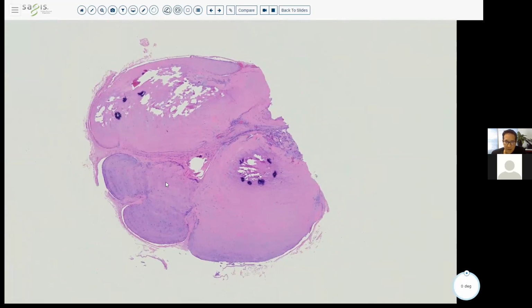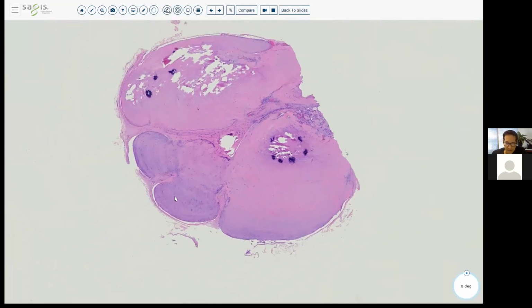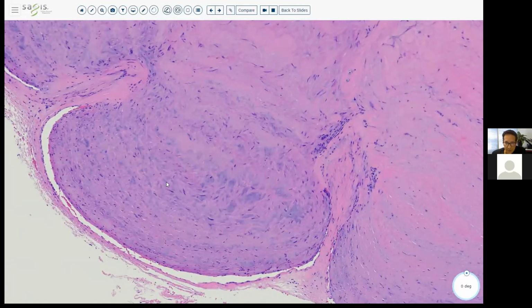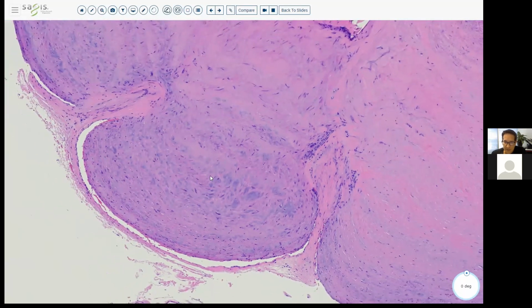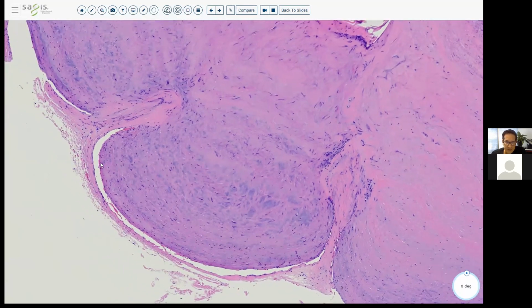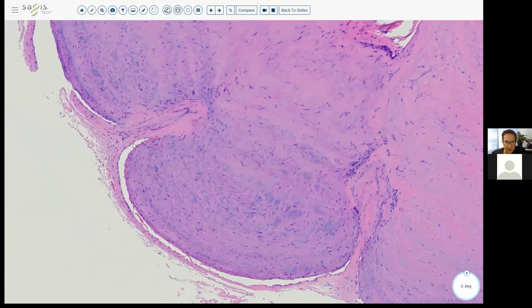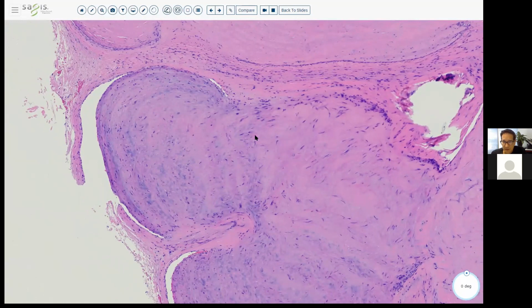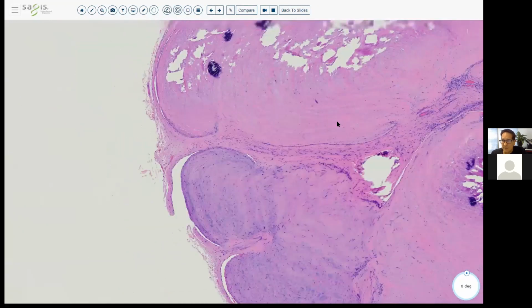This is a myofibroma. And if you go in, it's not very cellular. You can see these small cells, and they're within this kind of chondroid stroma. They make up this chondroid kind of matrix between the cells. And so this lesion is going to be really hard and firm, but very well circumscribed. Kind of have some artifact here with some clefting, similar to what you see in like a basal cell carcinoma. But these cells are small, spindled, and they have this kind of bluish chondroid matrix that they produce.